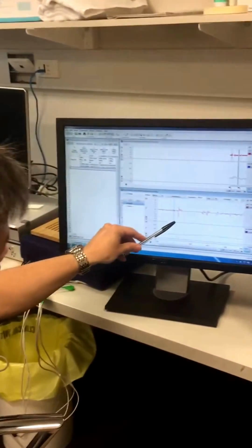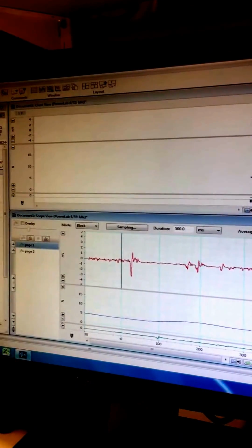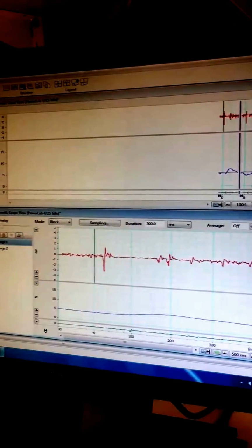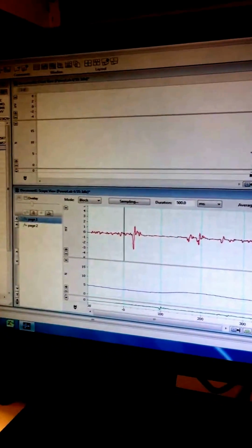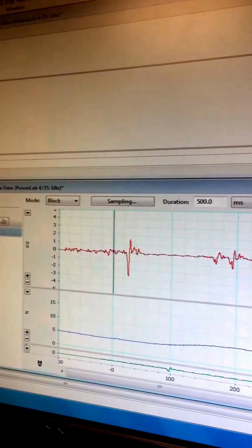The second one is you can see the waveform, and this represents the twitch in your finger when you felt the twitch move when I pulsed your brain, and that represents, well, for want of a better term, the circuits of the brain that are excitatory in nature. So what we have are nerves that excite other nerves and so forth to make your muscles move. And that gives us an indication of what we call the excitability pathway.